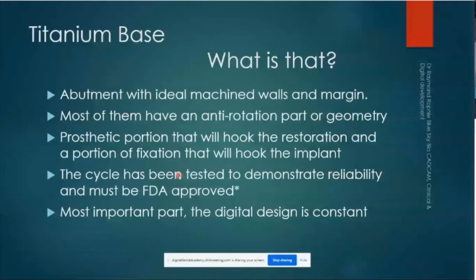Okay, so before talking about the titanium bases, or before talking about the crowns on the implants, it's very important that you all know what a titanium base is. The titanium bases are basically the abutments that will work on top of your implant, and these are digitally designed and digitally manufactured.